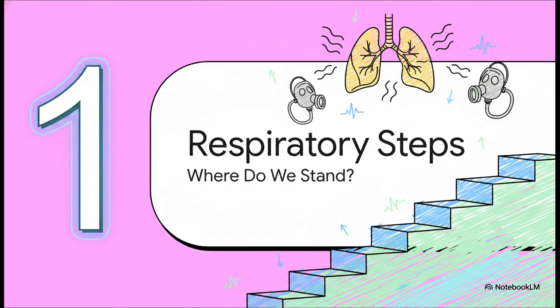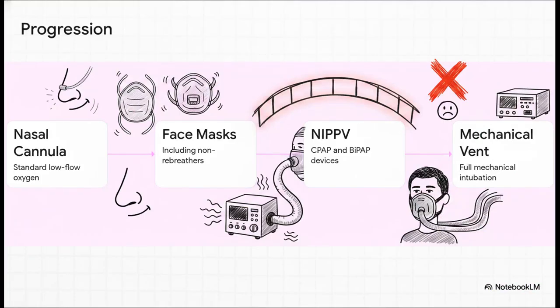Where exactly do we stand? To really get these masks and understand what they do, we first have to see where they actually fit in a struggling patient's treatment journey. Context is literally everything when we're escalating respiratory care. So think of it like an escalation ladder.